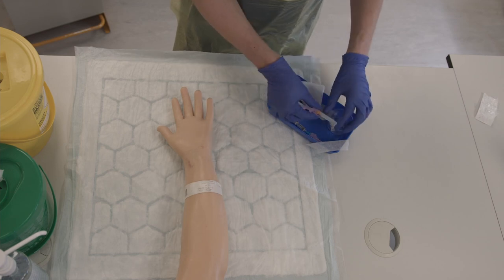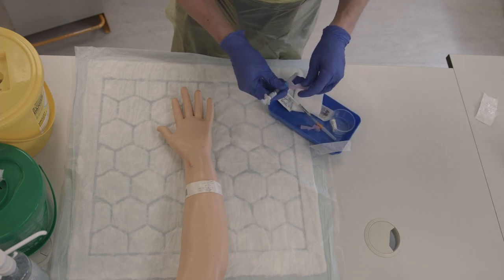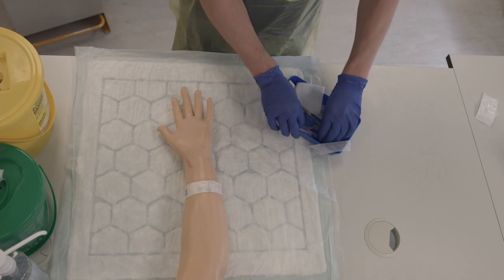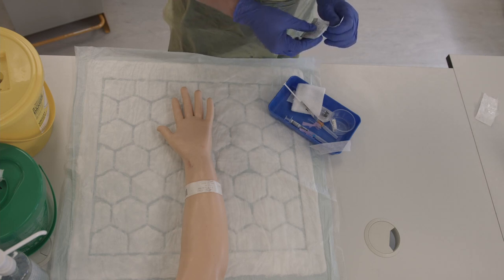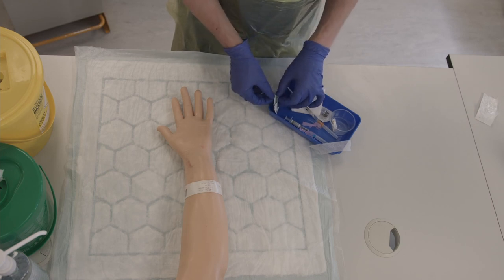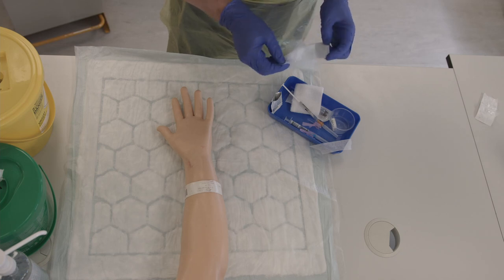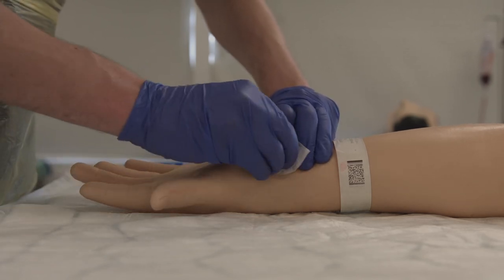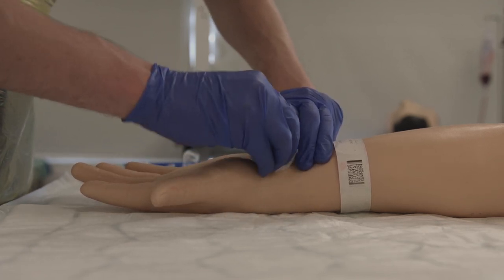Start by loosening the needle caps on both of your needles. Then prepare your chlorhexidine wipe. Palpate the radial pulse with your second, third, and fourth fingers of your non-dominant hand. When you are confident you are over the pulse, release your second finger and wipe the skin.